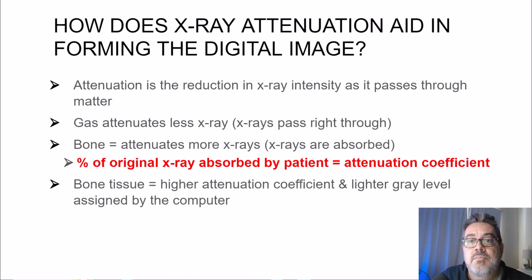But your goal is to obtain the highest quality image with the lowest radiation dose possible. You know that the big football player has higher tissue density in muscle, bone, and anatomical thickness than this nice little old lady. Those attributes of the football player are going to attenuate more of the X-ray beam when compared to the 90-pound soaking wet great-grandmother.